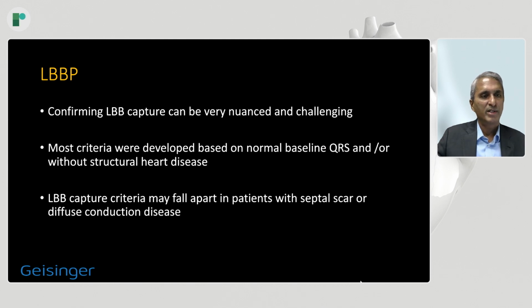However, left bundle branch capture has become very nuanced and challenging, and many of us have worked hard to develop guidelines and criteria to perfectly identify left bundle branch capture, but it's a work in progress. As you can see, in patients with scar and conduction disease, it becomes challenging.